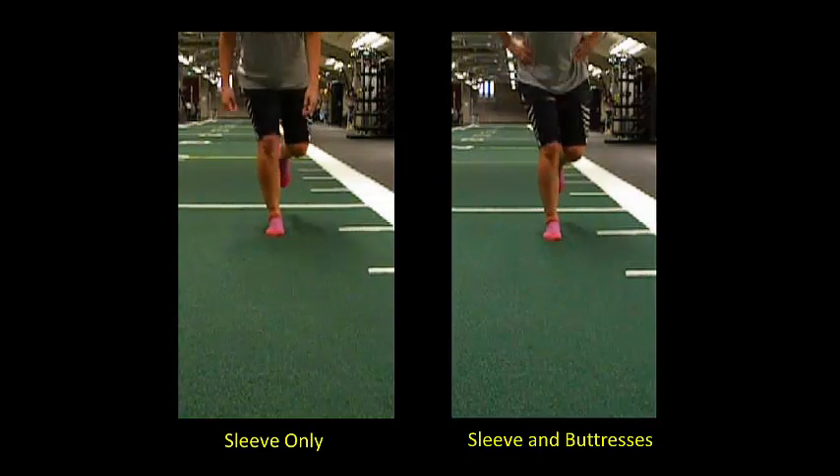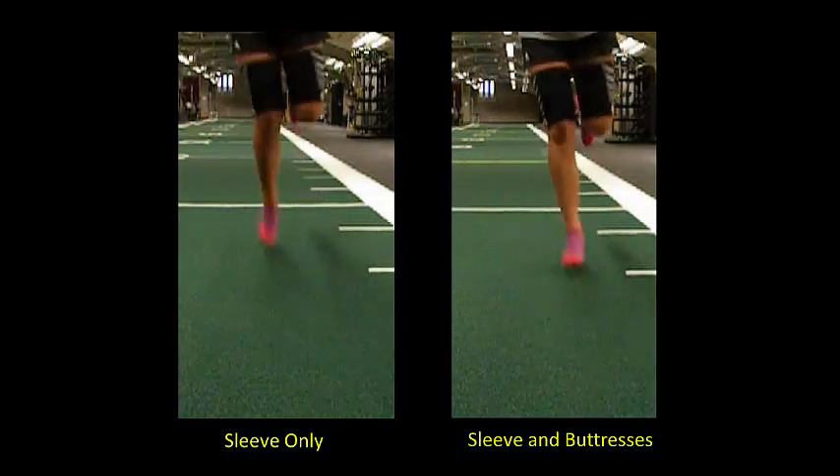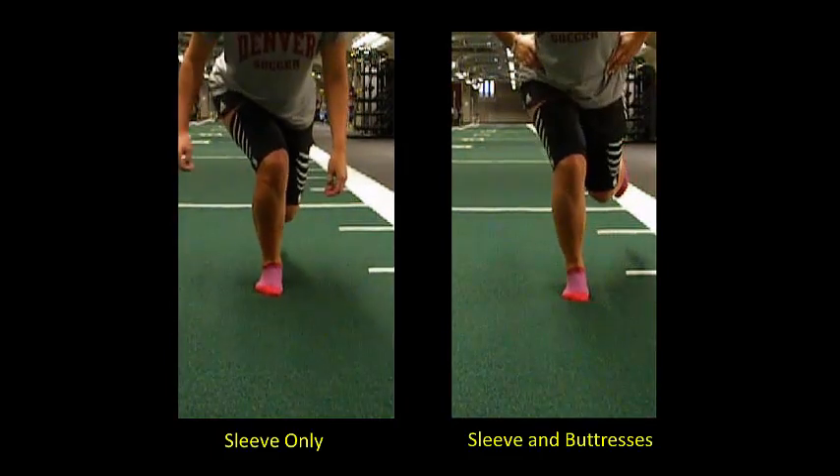On the left, the video shows that poor vertical knee alignment also coincides with the trunk rotating inwards and down, presenting a challenge to dynamic balance, whereas on the right, improved leg and trunk movement control coincides with improved dynamic balance.